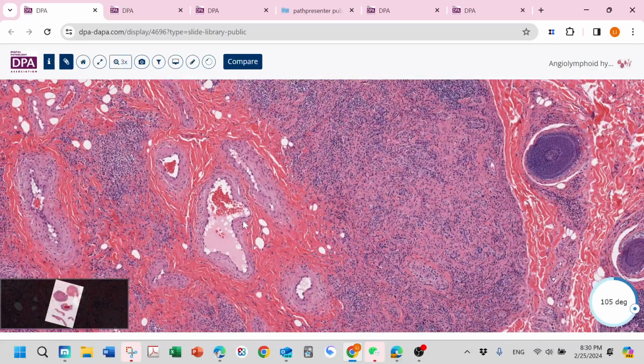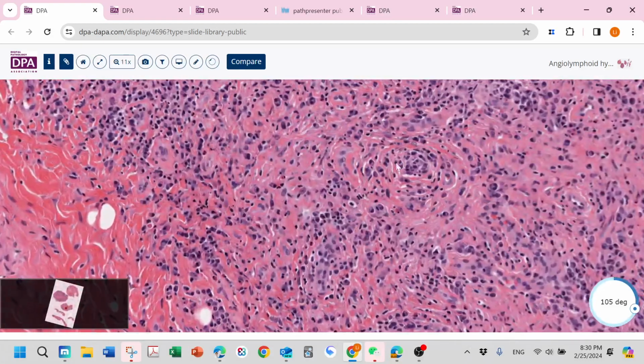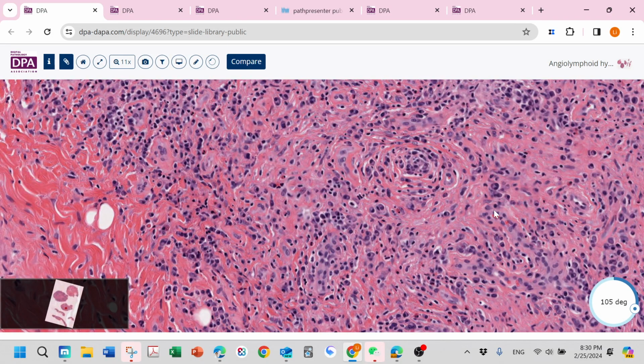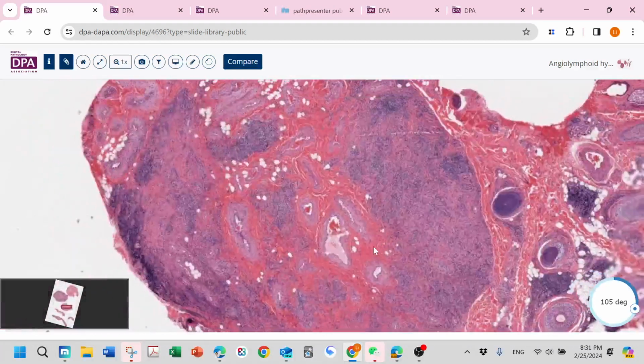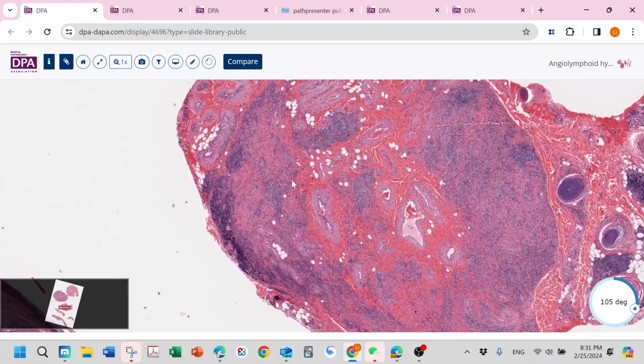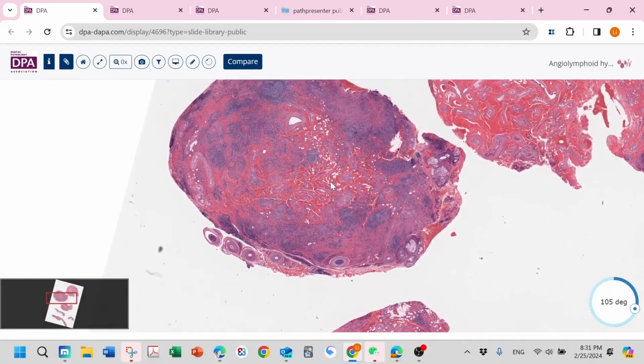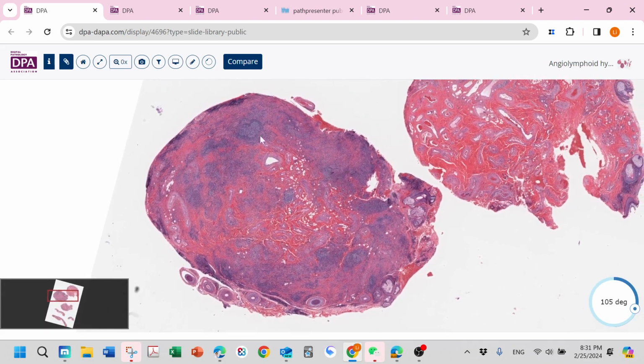So when you see this big blood vessel lumen, eosinophils, and around it this spindle cell proliferation, they try hard to form a lumen, but get squeezed by collagen or other structures around. They just cannot make a mature blood vessel. That is ALHE, aka epithelioid hemangioma. So: inflammatory cells, a big vessel, and then small slit-like vessels around.